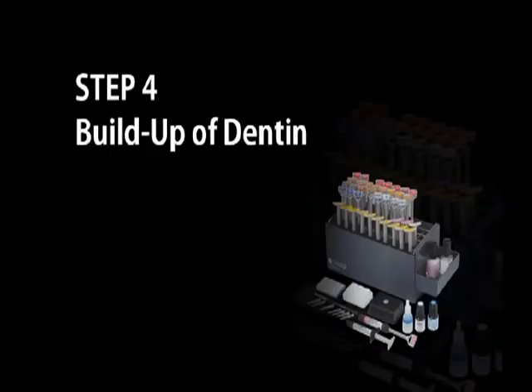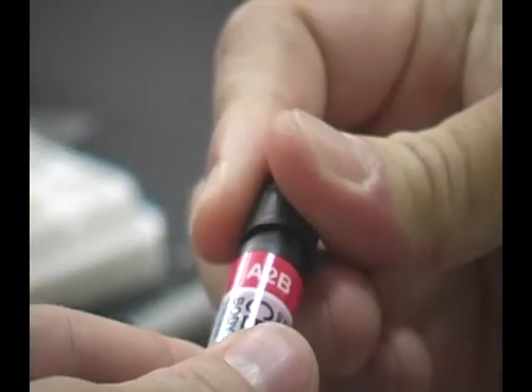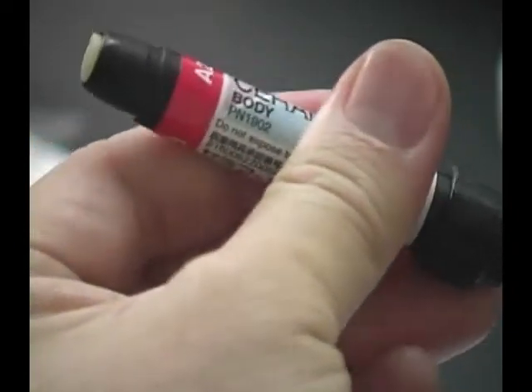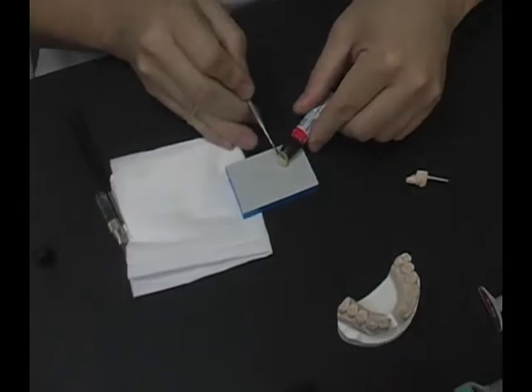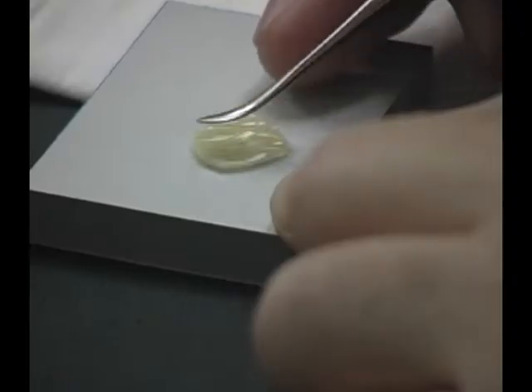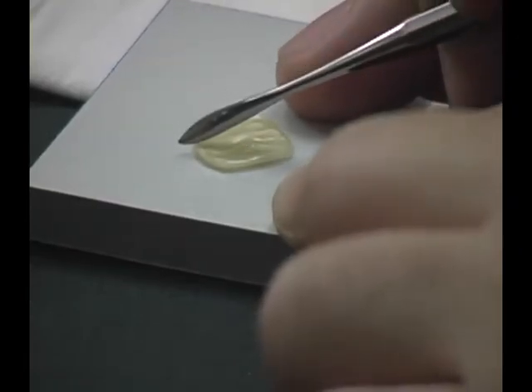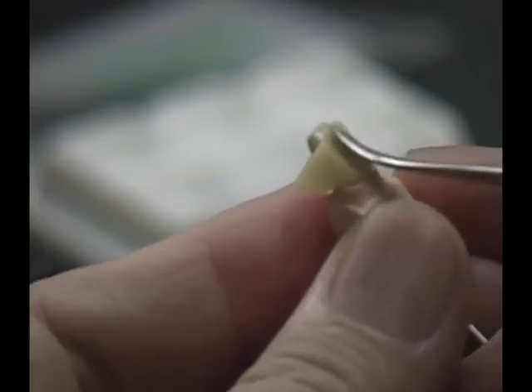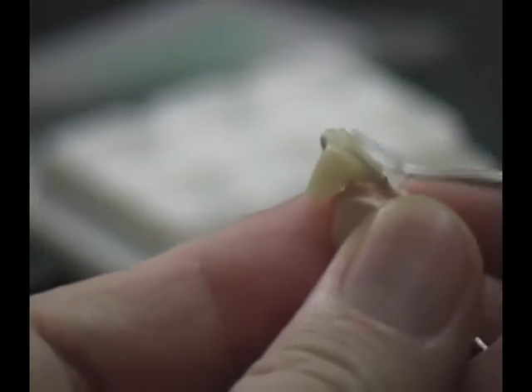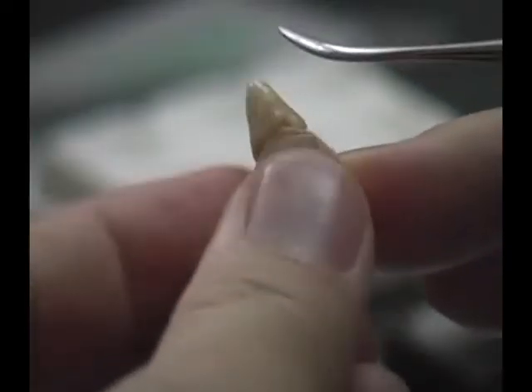Build-Up of Dentine. Select the shade of Ceramage Body and dispense the required amount onto the paper pad. Press the material to a thin circle and take half to apply over the die. Gently adapt the material over the entire surface and ensure that no air bubbles are included. Ceramage is easy to handle and doesn't stick to the instrument.